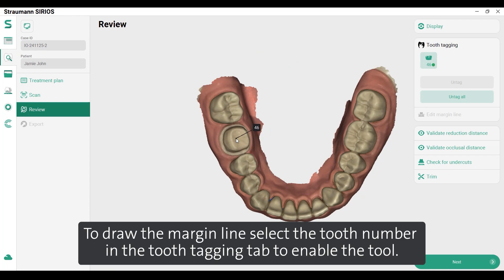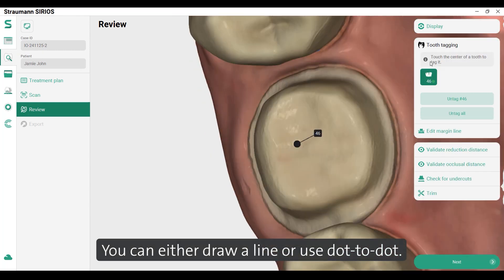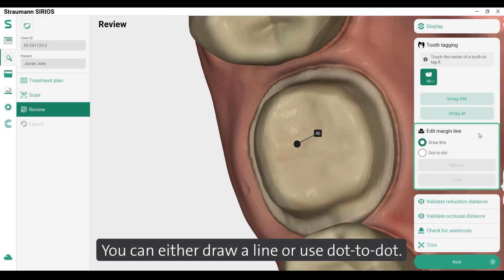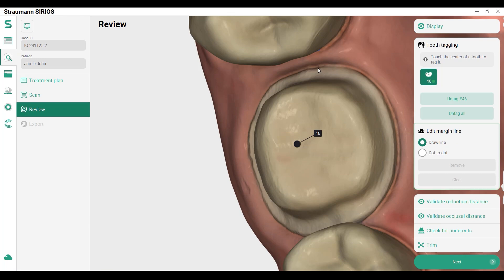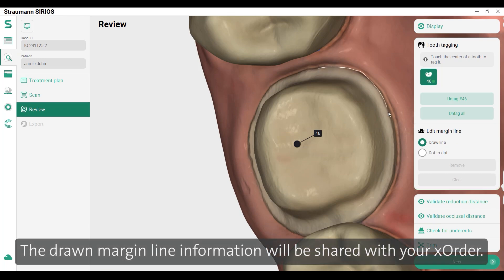To draw the margin line, select the tooth number in the tooth tagging tab to enable the tool. You can either draw a line or use dot to dot. The drawn margin line information will be shared with your order.